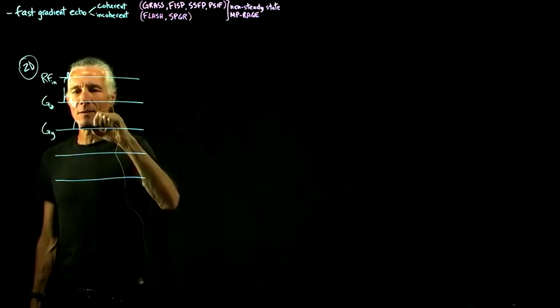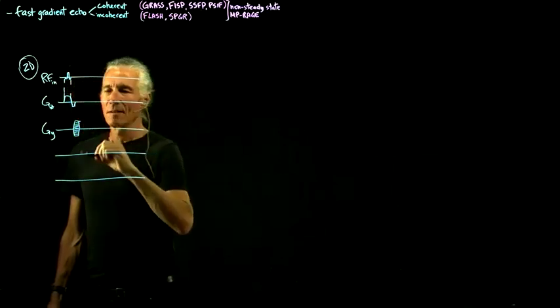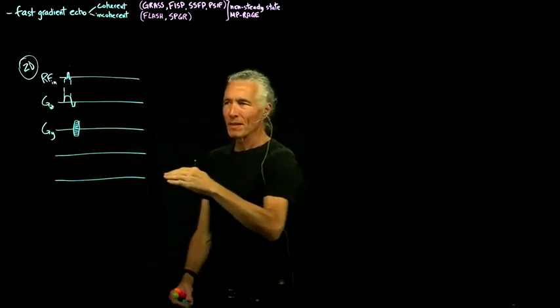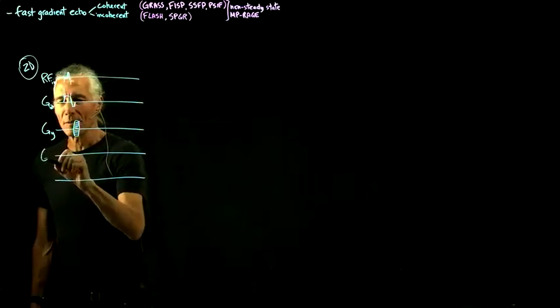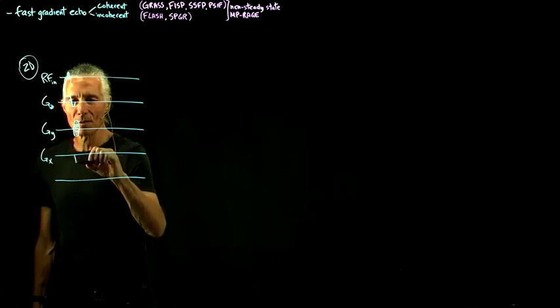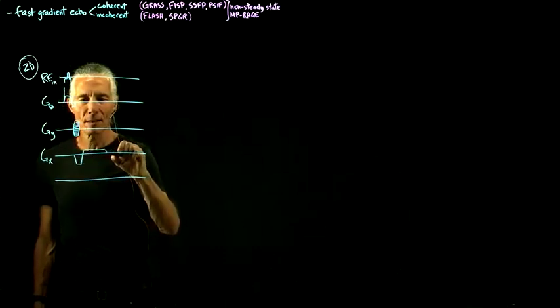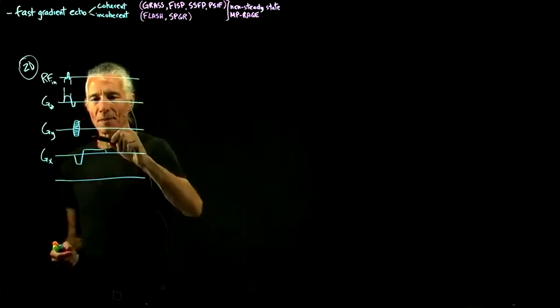We pick one of these settings of the phase encode gradient to wrap up horizontal stripes in the Y direction. And then we do a readout. First we go to the left side of k-space, and then we go across k-space. And in the middle, we get a gradient echo.